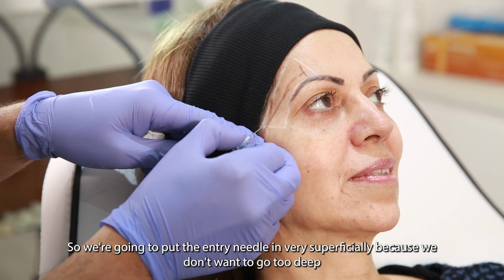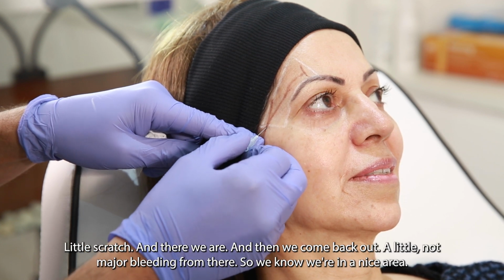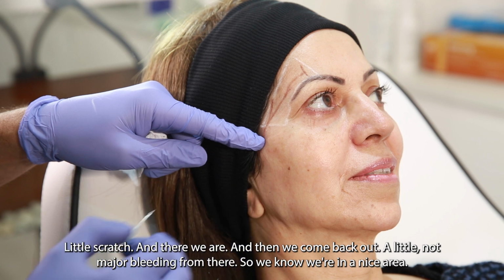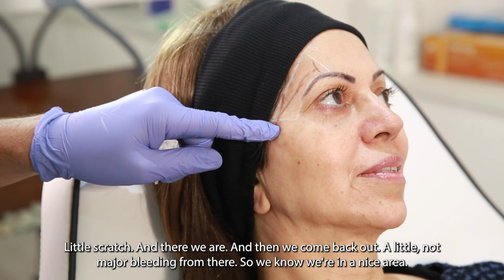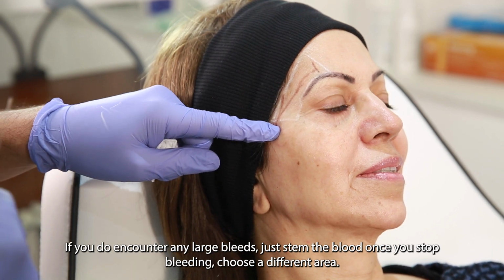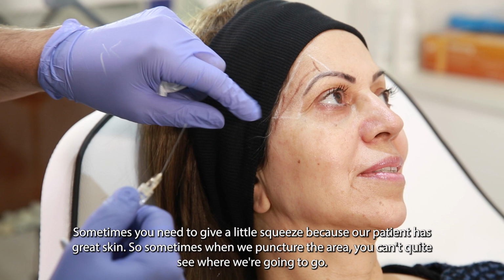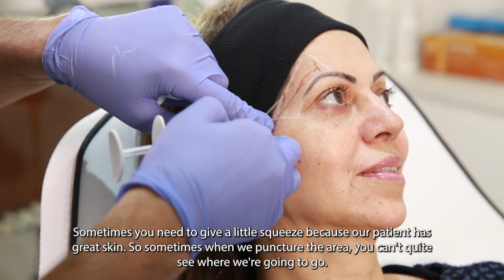So we're going to put the entry needle in very superficially because we don't want to go too deep. Little scratch, and there we are. And then we come back out. No major bleeding from there, so we know we're in a nice area. If you do encounter any large bleeds, just stem the blood, and once it stops bleeding, choose a different area. Sometimes you need to give it a little squeeze because our patient has great skin, so sometimes when we puncture the area, we can't quite see where we're going to go.